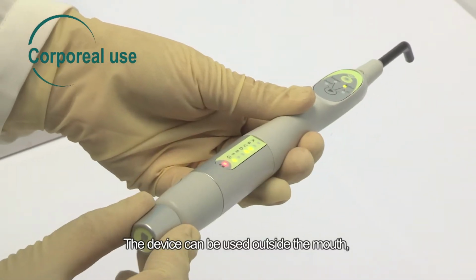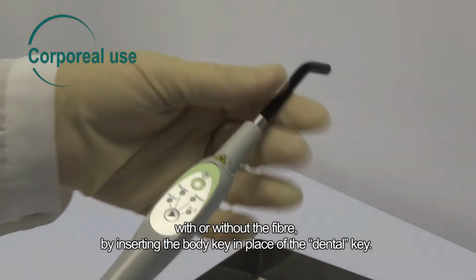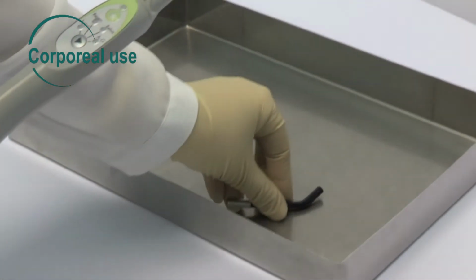The device can be used outside the mouth, with or without the fiber, by inserting the body key in place of the dental key.